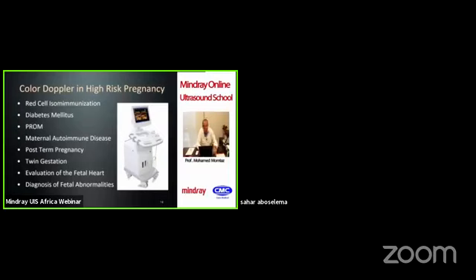But even if you don't do it yourself, to understand what to do and when, you need to study it, because you will send a patient for ultrasound, you will get a report back saying PI is 1.2 and the patient is 32 weeks. Is this normal? Is this abnormal? It is normal. Then you send the patient for another Doppler evaluation because you think the baby is IGR.